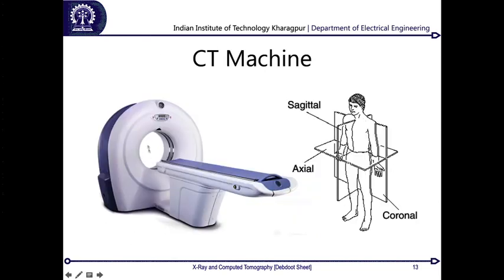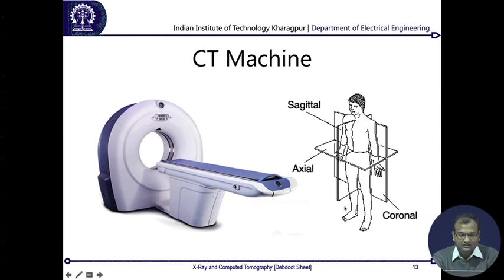So finally this is what a CT machine actually looks like. And now in general for imaging we follow certain conventions. So a human body is basically divided into 3 planes. As in for real life objects, you have 3 axes, x, y and z. In case of medical images, it's basically 3 orthogonal planes in which it's defined, because when you are looking at those images, you will be seeing one particular plane of a 2D slice.